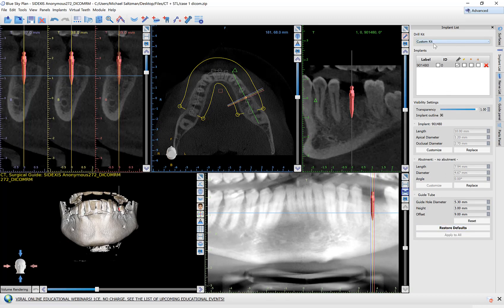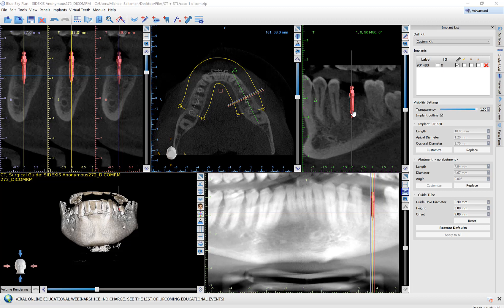What custom allows you to do is, for a particular implant that you've placed, it allows you to change and customize any of the fields, including the field for the guide tube, which has the guide hole diameter, height, and offset. For example, let's say we go ahead and change this to 5.4 for the guide hole diameter for implant 901480.